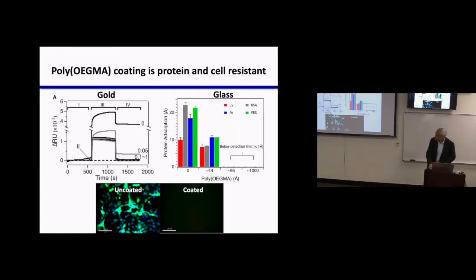So how does this work? It works shockingly well. So many times I had this idea that this should sort of work, but I didn't know how well it would work. And this is really very old data, now 15-year-old data, which was published in Advanced Materials in 2004. But the student came back and showed me some data where he made a series of coatings. Zero means no coating. It simply means you have gold and you've attached an initiator, but didn't do the polymerization.